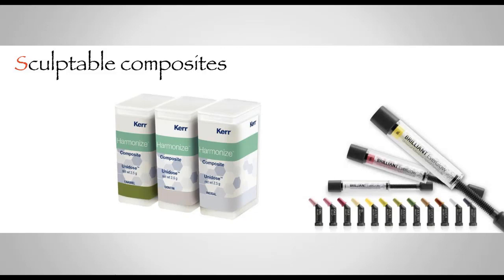So again, can I use any other type of composite besides flowable composites? And the answer to that question is yes. You may use sculptable composites. You may use something like Harmonize. You may use something like Brilliant Everglow from Coltene. You may use any type of regular sculptable microhybrid or nanohybrid composite that you use in your practice.